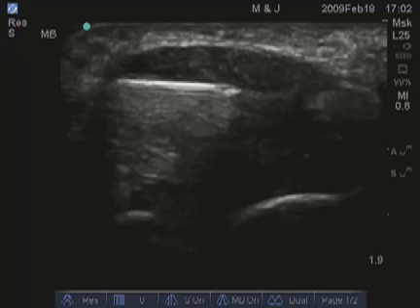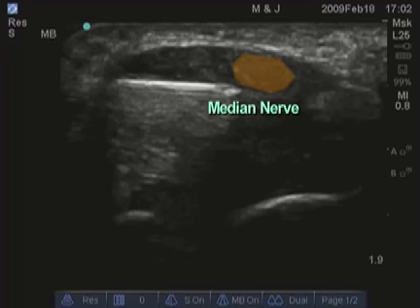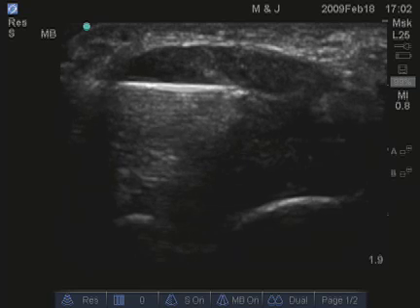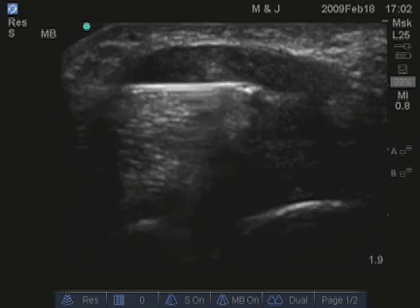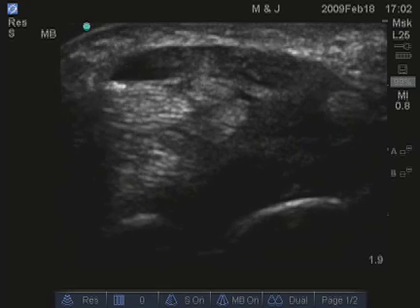In the next brief video, the needle is seen deep to the median nerve — so the nerve is here, and the needle can be seen underneath it. And again, injection with lidocaine and steroid is performed.